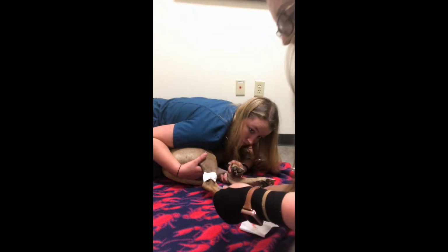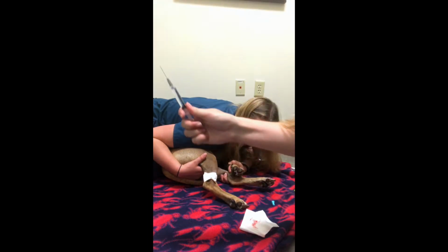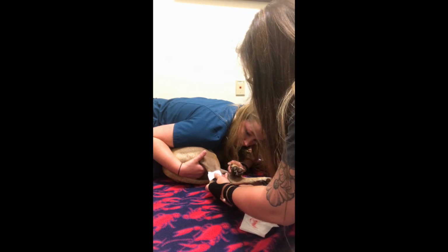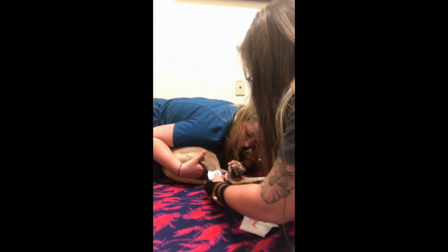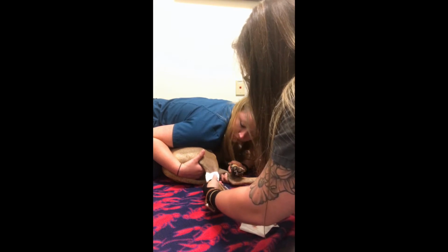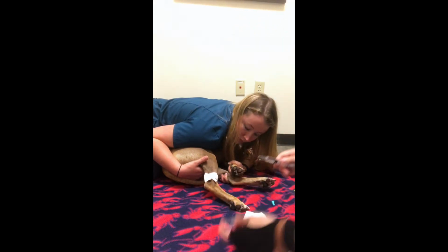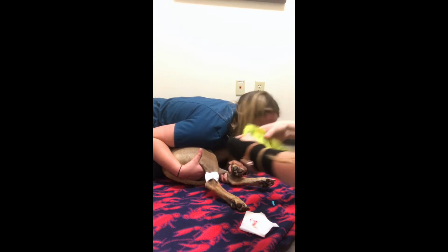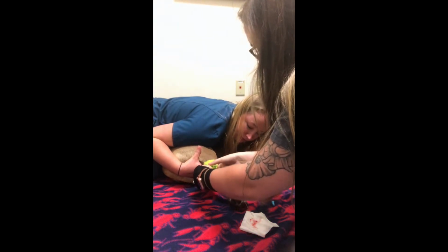Our heparinized saline here. We're going to flush it to make sure it is in. And we have a good flow there. Then we're just going to wrap it with some no chew so she'll be ready for her surgery.